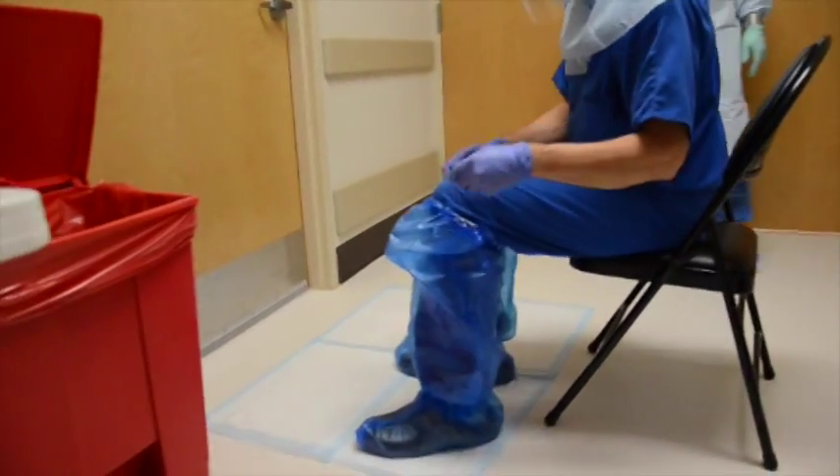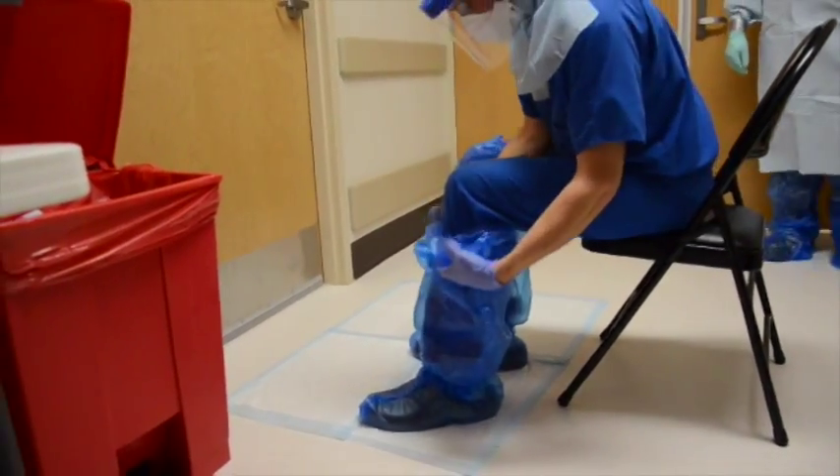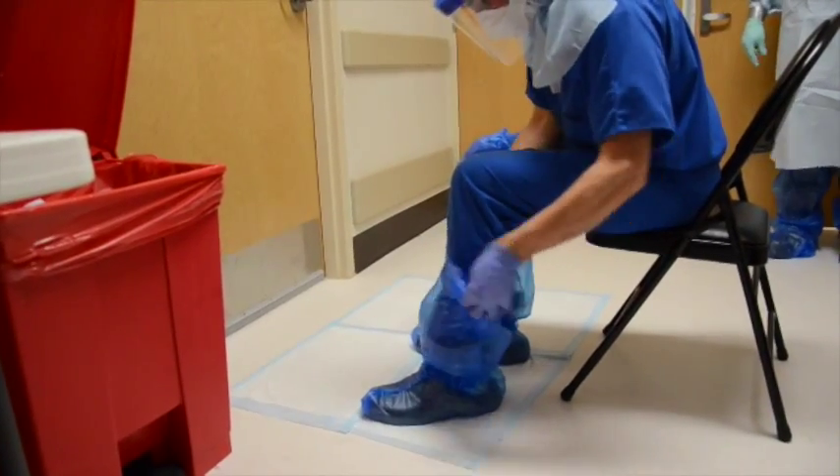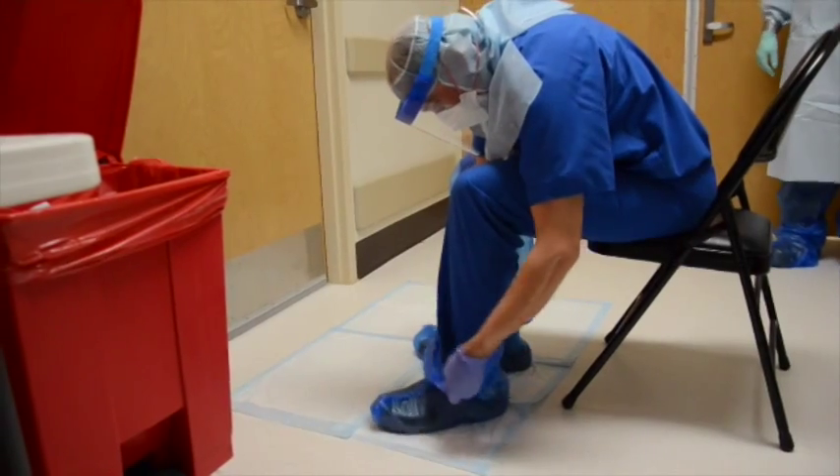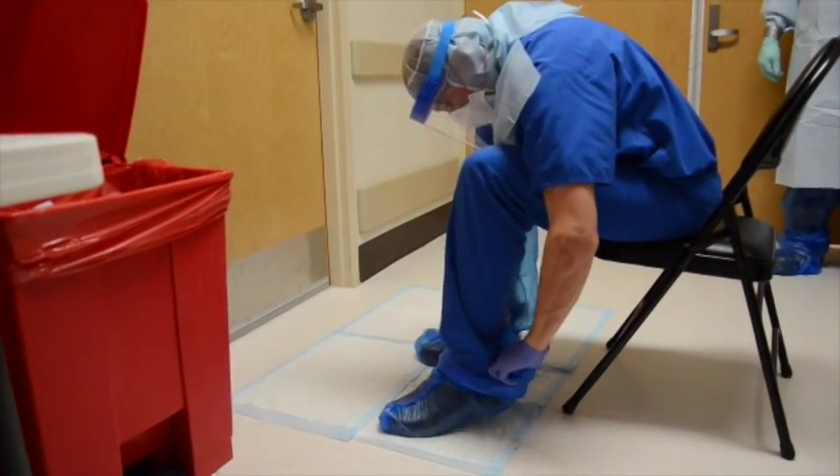Remove leg coverings one at a time, rolling dirty side in as you remove them. After removing leg cover, step to the clean area of the floor to avoid contamination. Refrain from stepping on the dirty doffing pad again.